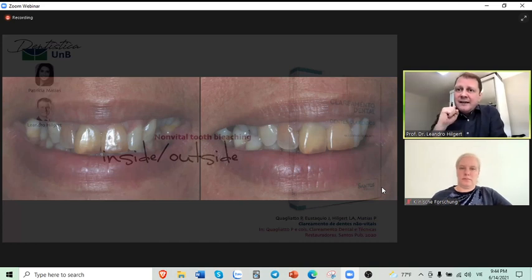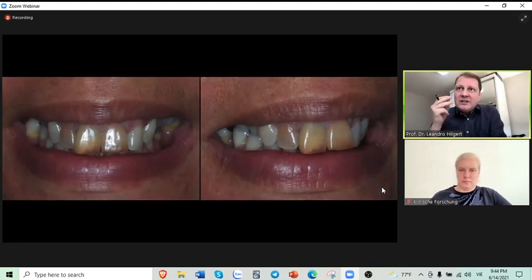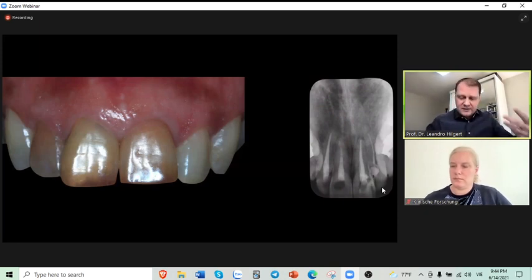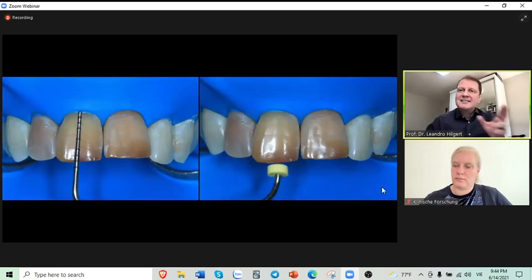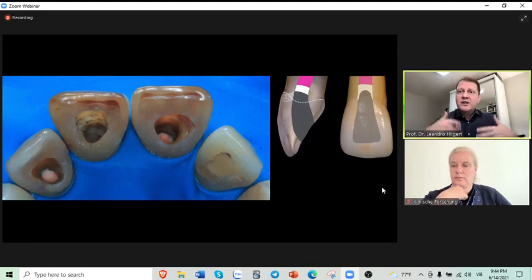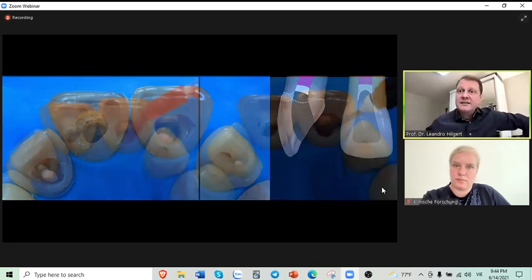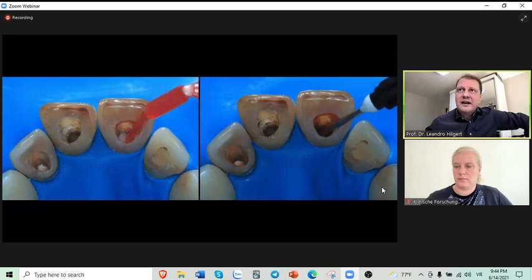In a very, I would say, challenging case, this patient came to us with 3 teeth that were very, very dark. And my PhD student, she's an endodontist, retreated the endo of these teeth, and then we performed the inside-outside bleaching technique. It is one that I like a lot. So here we're measuring the clinical crown of the tooth and removing the endodontic material and the previous restoration, and doing this cervical barrier is the most important part that we need to do always if you're doing a non-vital bleach or an internal bleaching, as some like to call.